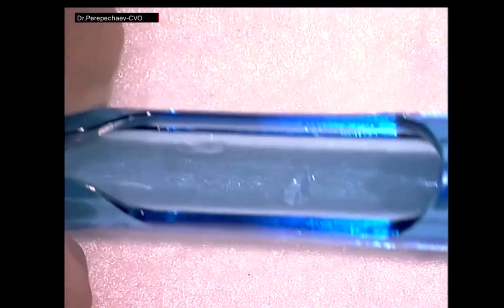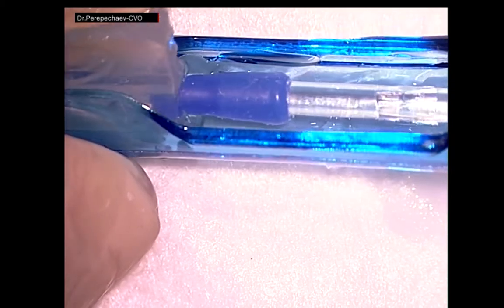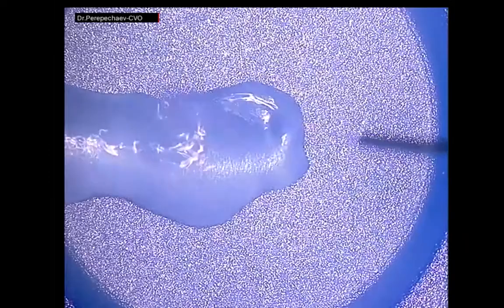After the lens is completely folded, we firmly connect the wings of the cartridge with our fingers. Then the cartridge is tightly closed, we should feel a faint click. After that, we insert the cartridge into the injector, push the cartridge as far forward as possible until it stops, and slightly insert the plunger of the injector with the tip into the cartridge, as shown in the video. Thus, the entire system, lens, cartridge and injector, is ready for implantation.